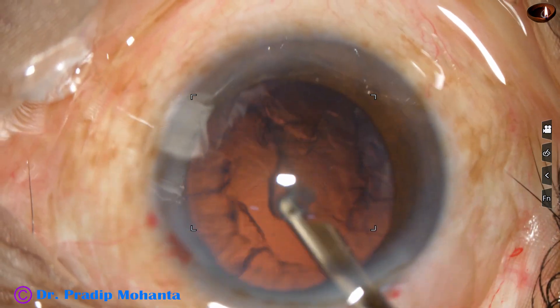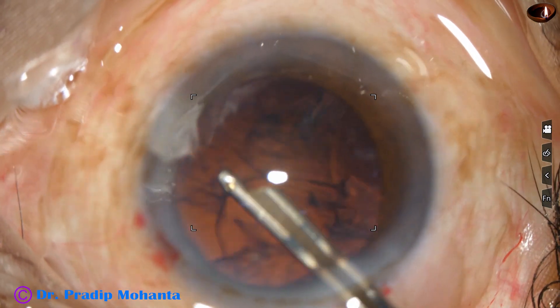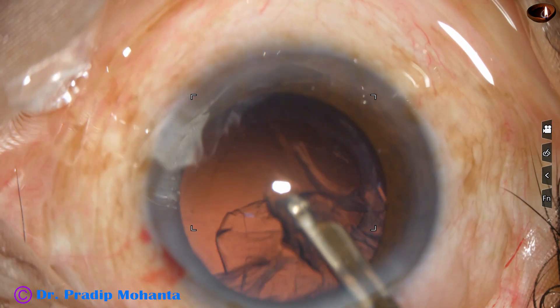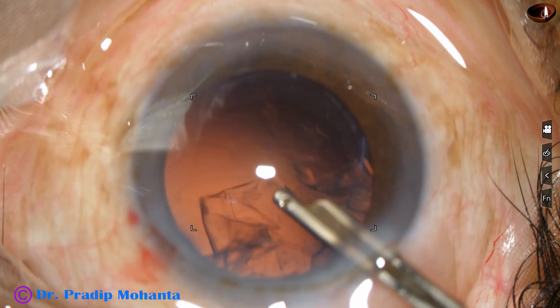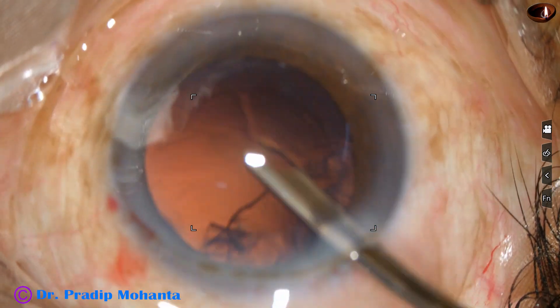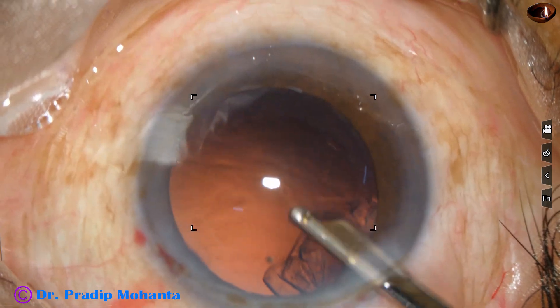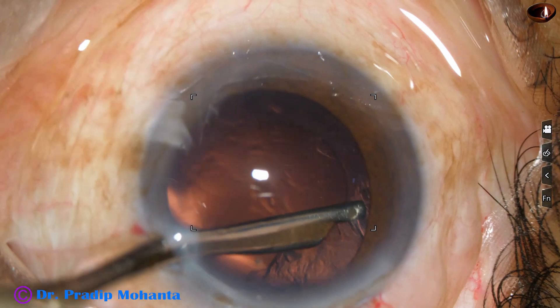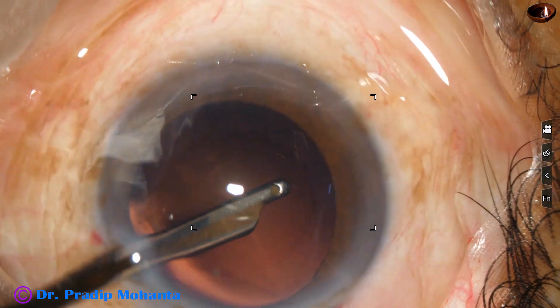I am using an I/A cannula to clean the cortex. I make only one side port; the width of the side port is about 1.6 to 1.7 millimeter. There is no side port on the right side, and most of the time I remove the sub-incisional cortex through the left side port.